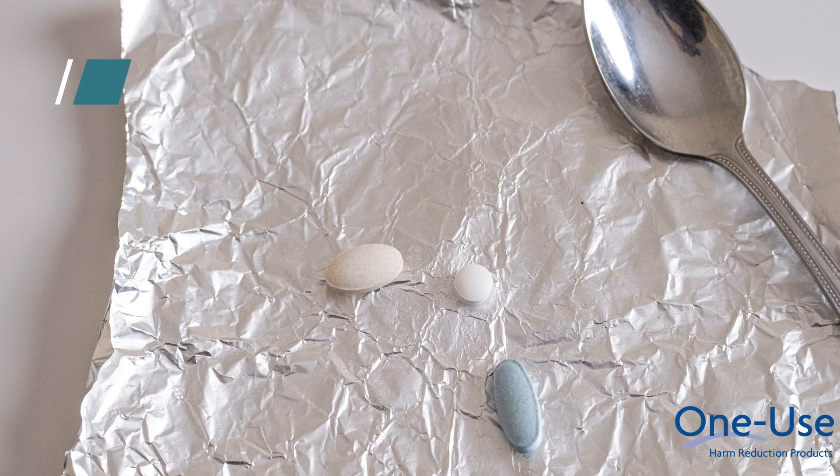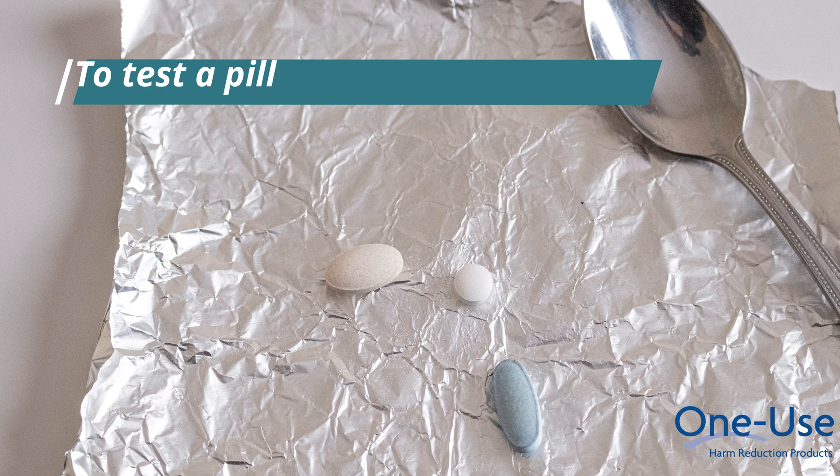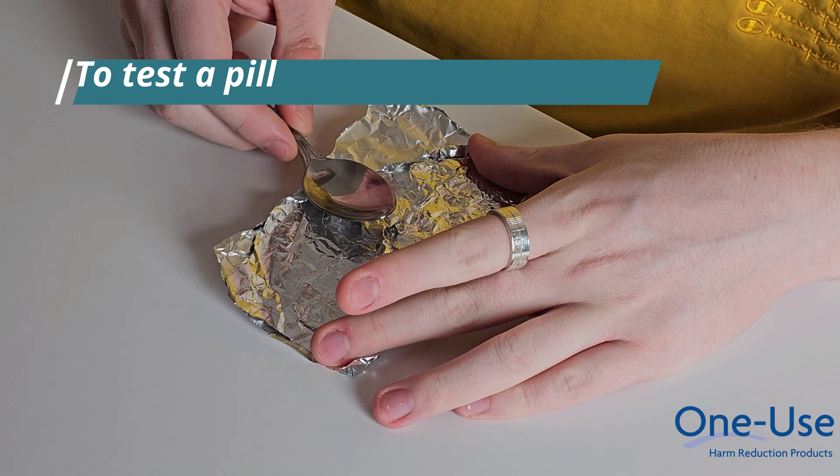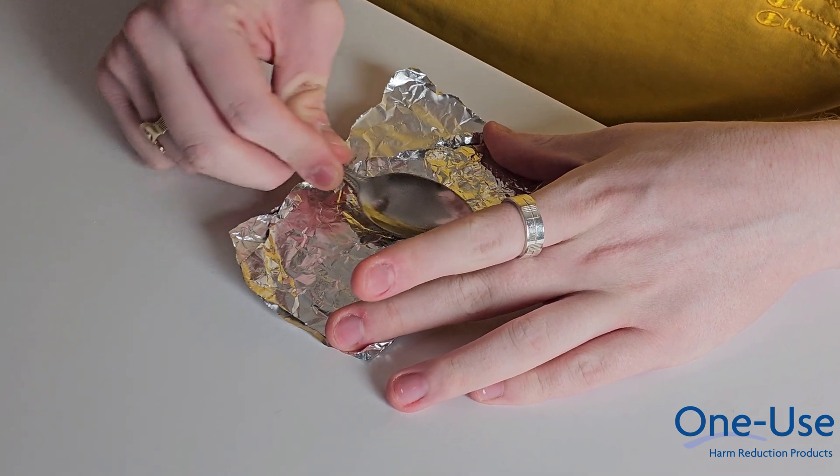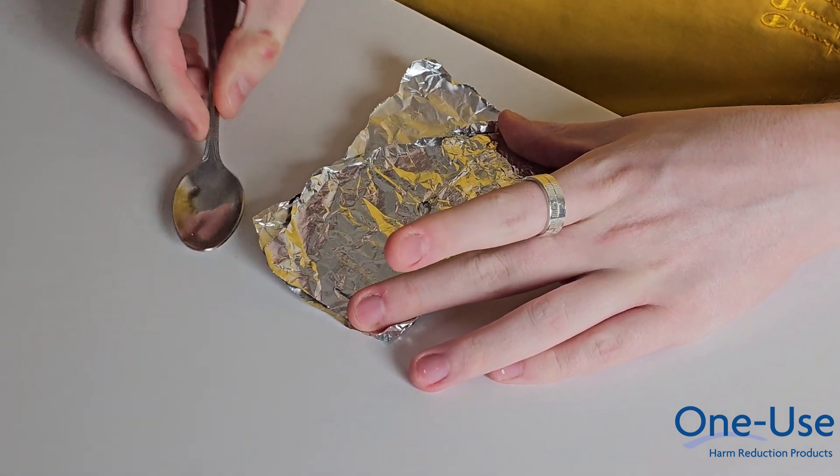A drug in a pill form will first need to be crushed into a fine powder. To prepare a pill for testing, place the entire pill in some foil, fold the foil, and using the back of a hard object, crush the pill into a fine powder.